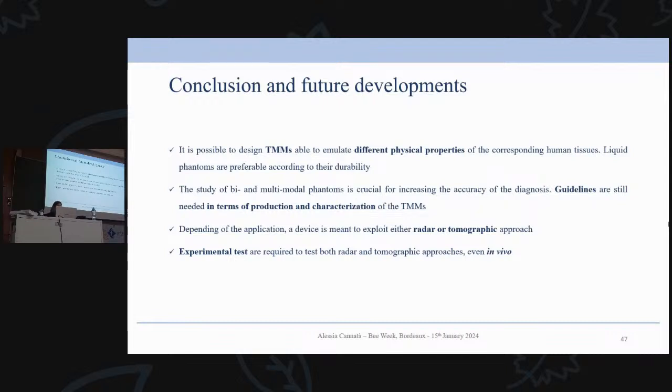We have seen that the liquid phantoms are better. In my work I tried to characterize some phantoms from a multimodal point of view, but there is still a need for specific guidelines in order to produce the phantoms and characterize them. For example, for the mechanical characterization there is no standard, and the acoustic one as well.